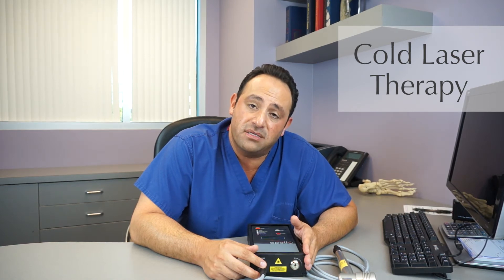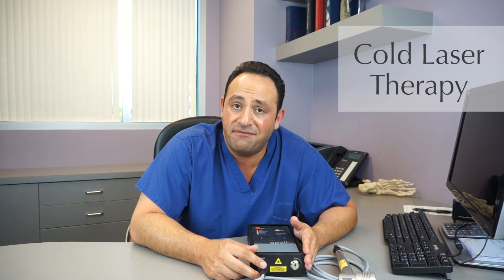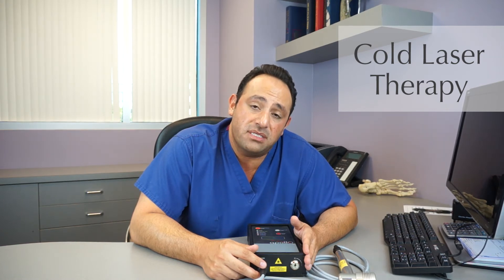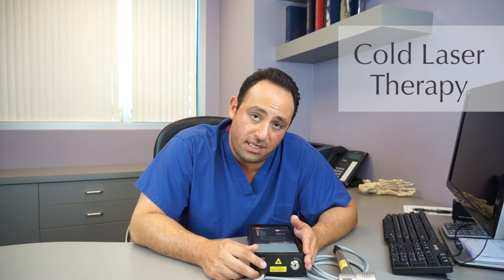Has there been studies that have proven the effectiveness of this cold laser and is it FDA approved? Yes it is. As previously said, 3,000 studies have proved the effectiveness of the cold heat laser.